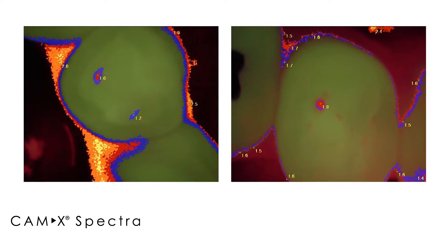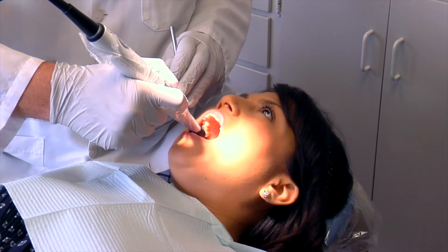A picture is worth a thousand words and when a patient sees that it really explains a lot to them. It also saves us dentists quite a bit of time explaining what is actually happening in their mouths. So that device has many benefits for the dentist.